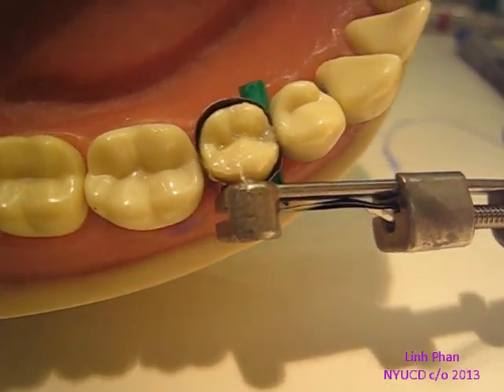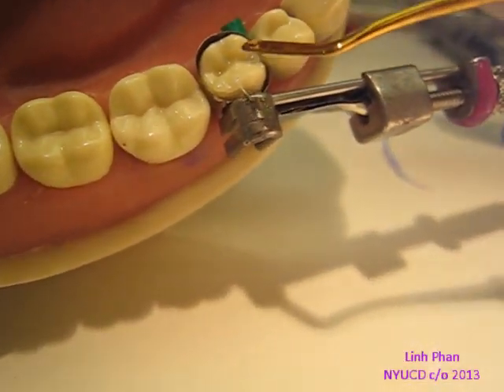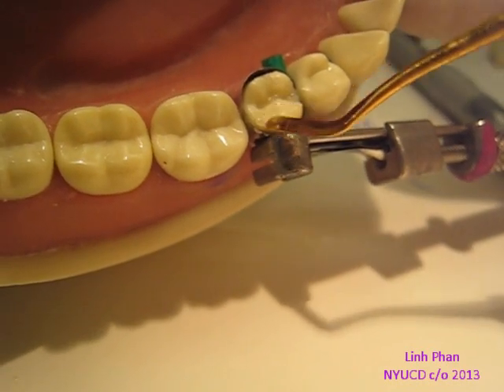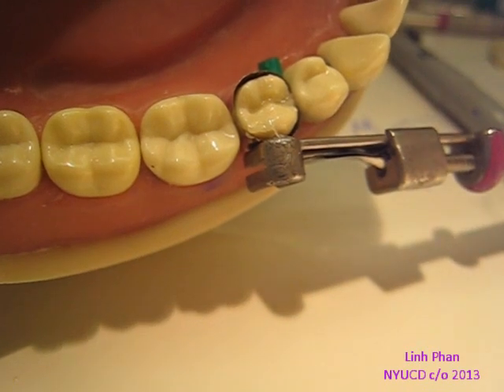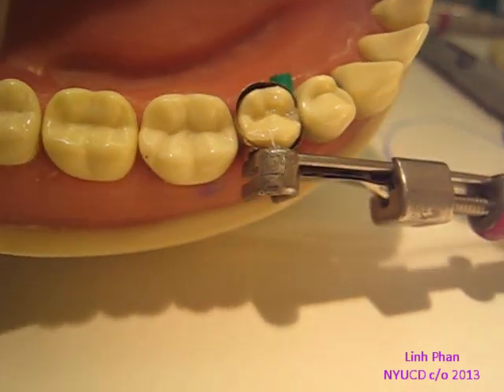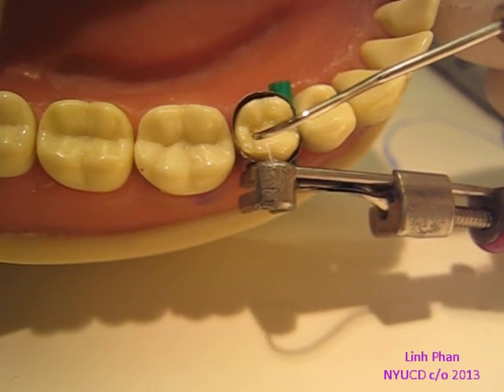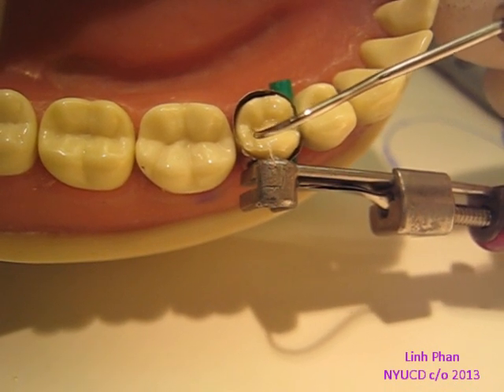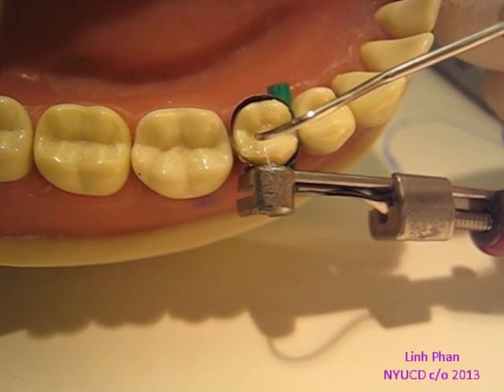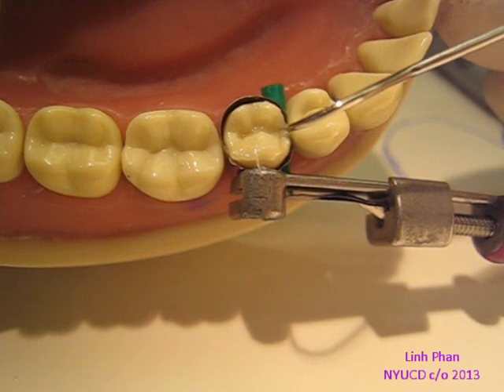Always make sure you don't underfill because that'll give you problems. On the side, if you want, you can go in with an explorer — get a little bond on the tip of it so it doesn't stick — and you can push and give it a little more shape there, so that way you can get a fossa on both sides.